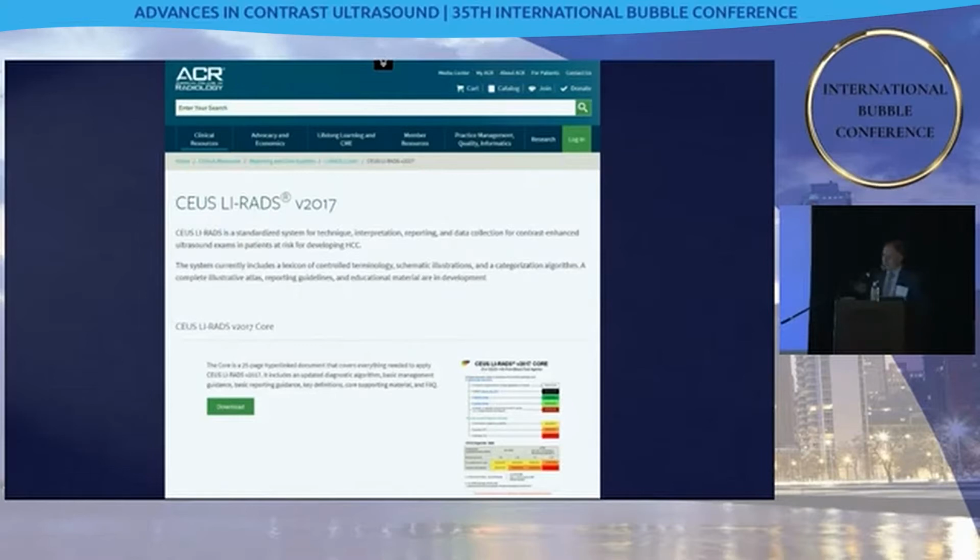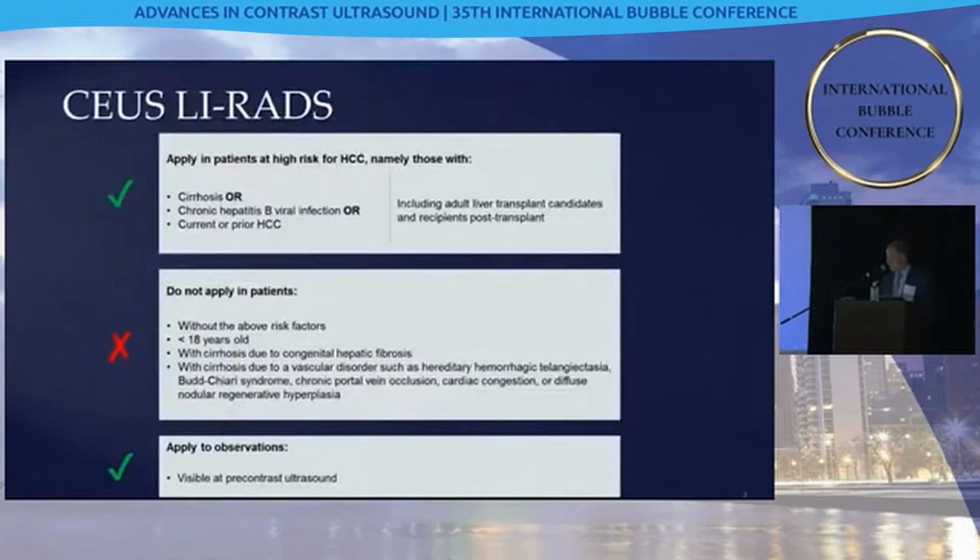Without this system, we could detect lesions, we could see them, but our specificity was pretty poor. If you used some guidelines, the specificity was probably close to 75%, which was obviously not good enough to send those patients straight to treatment. But now with contrast-enhanced ultrasound LI-RADS that we developed in 2017, we have a very nice system to classify findings, and we drastically improved our specificity.